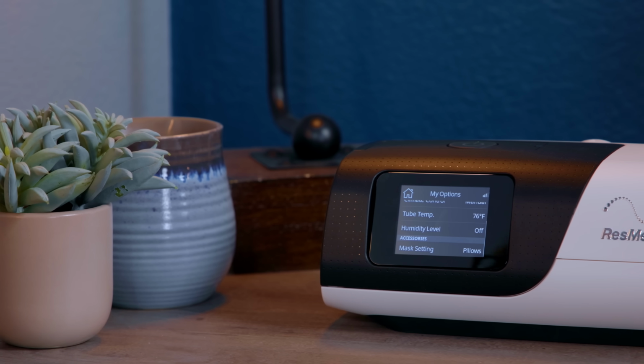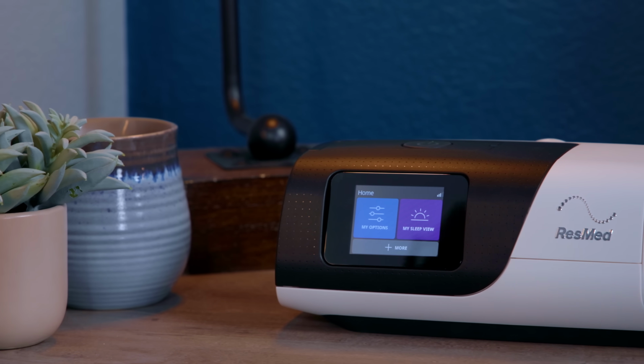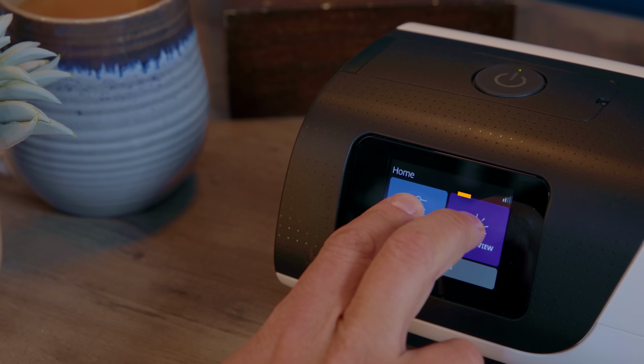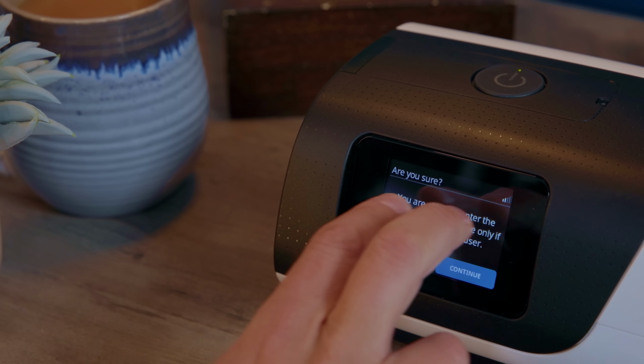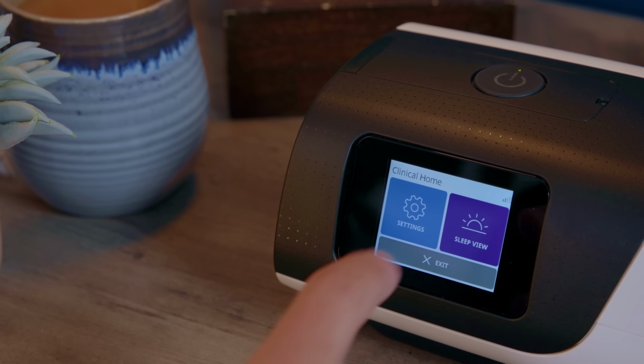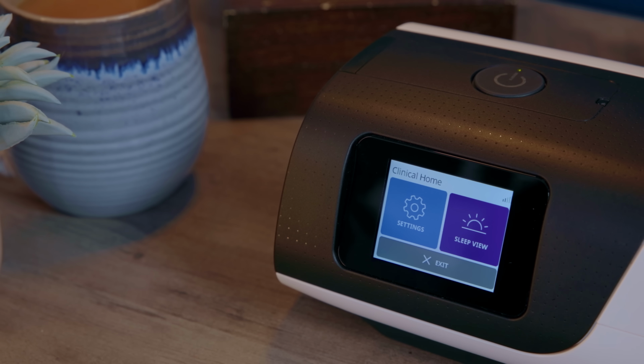To access the clinical menu, go to the home screen of your machine and press and hold both the My Options and the My Sleep View buttons for about 3 seconds. If this is the first time that you've done this, the machine will ask whether you want to continue. Once you confirm, the background will then turn white. It will say Clinical Home at the top, the More button at the bottom will now be Exit, and My Options will change to Settings. To get back to the home screen, just click the new Exit button, but we don't want to do that for now. With the clinical menu now available, press the Settings button.